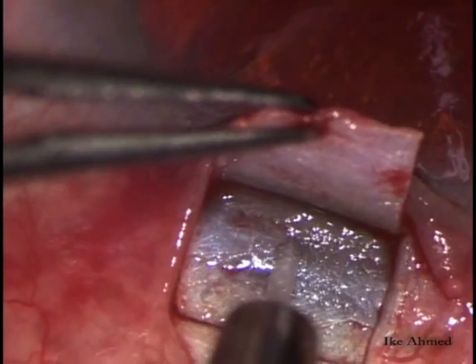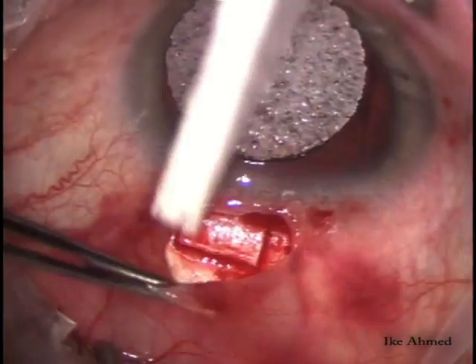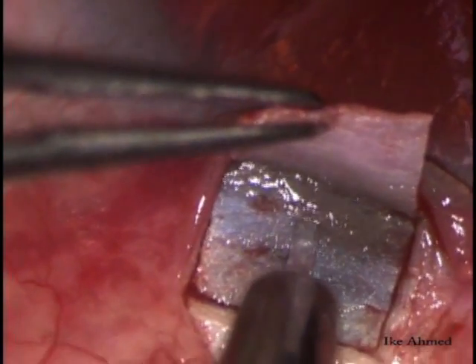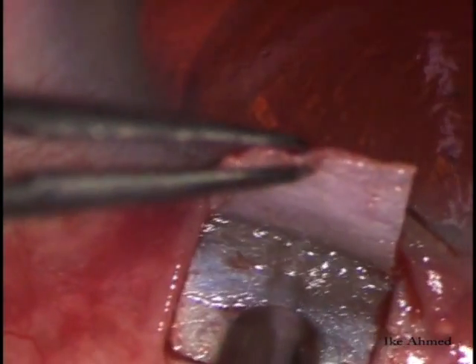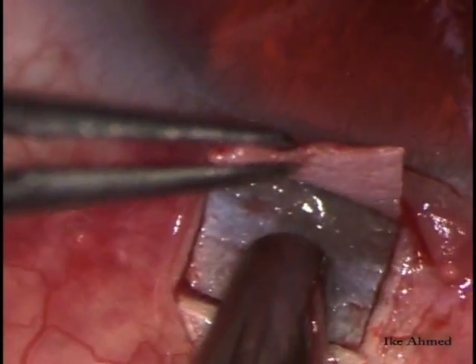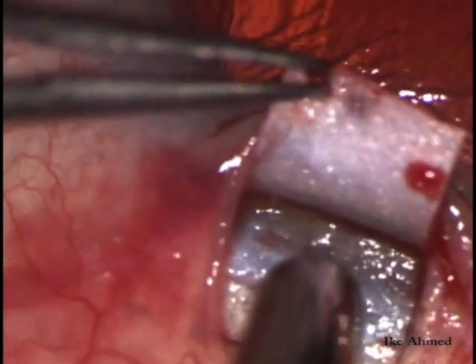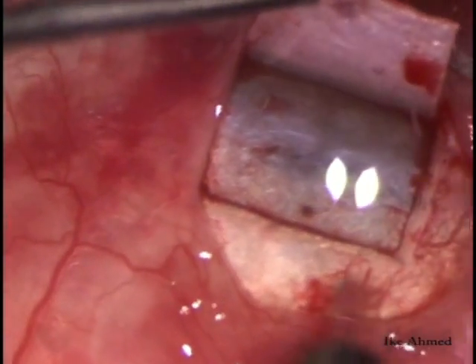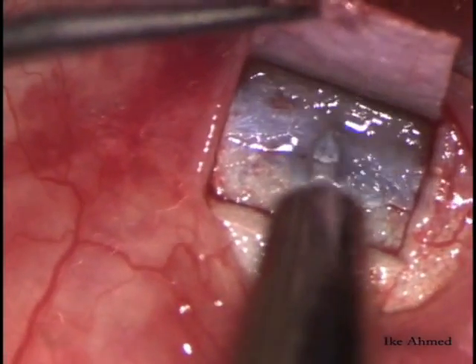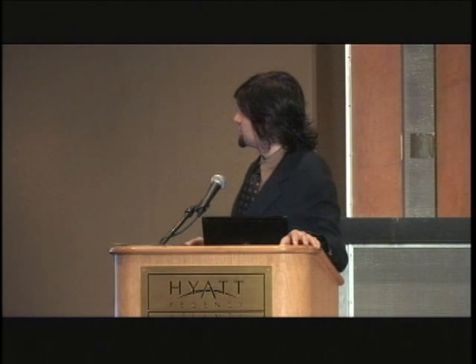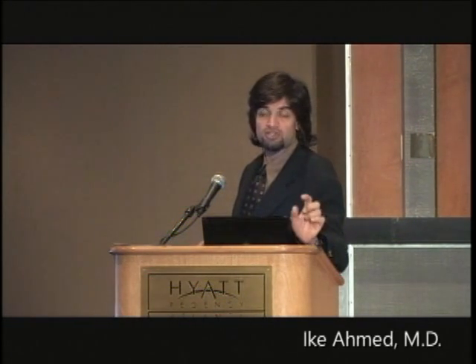A 400 micron sapphire blade is very nice to use for entry. We're looking at where we want to be — just at the anterior aspect of the spur, in the center of the dissection at iris plane. It helps to have the eye turned down a little bit, with a second instrument or forceps holding the eye during implant insertion. One of the nice things, as Gary mentioned, is that AC shallowing is very uncommon — it really doesn't happen unless there's a positive pressure situation. That's a big advantage compared to trabeculectomy, where making a hole with a punch or scissors typically leads to some shallowing.